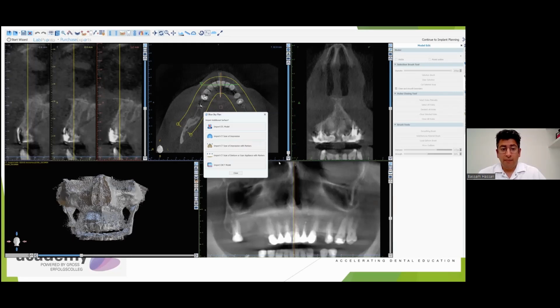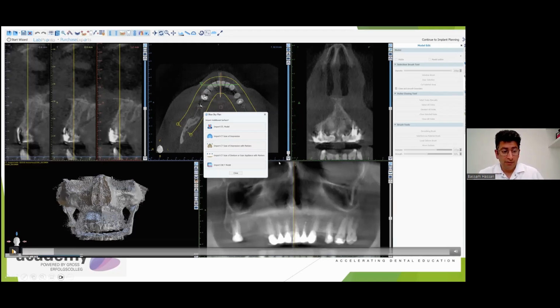Some scans might look acceptable diagnostically, but because the patient has moved a lot during the scan, or because the scanner does not allow you a shortened scan setting, half rotation scans like 7, 8, or 9 seconds, even a scan that looks acceptable by post-processing will give the AI difficulty creating surfaces to match with the intraoral scan, just like you'll see in this case.